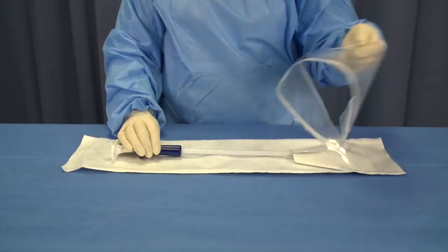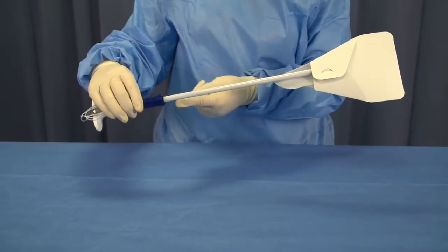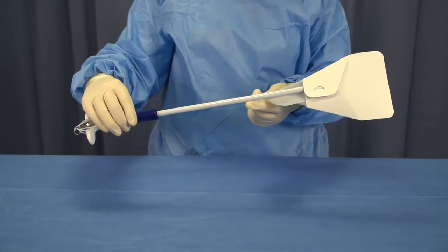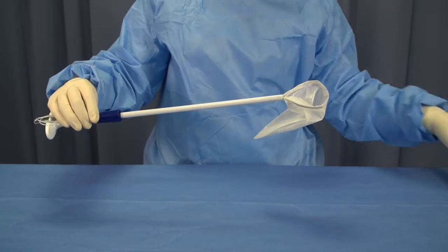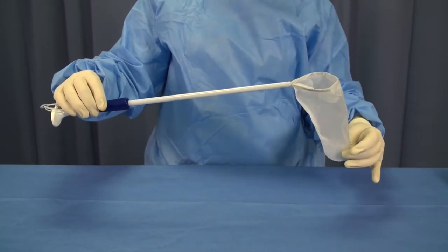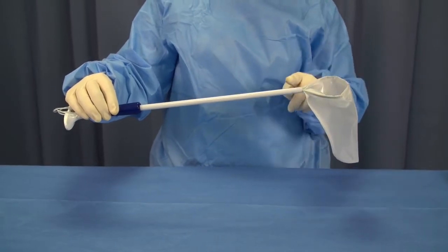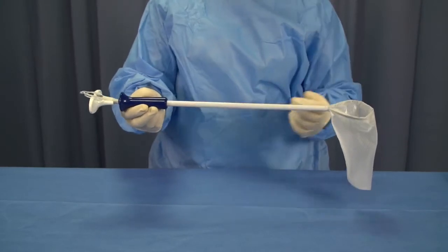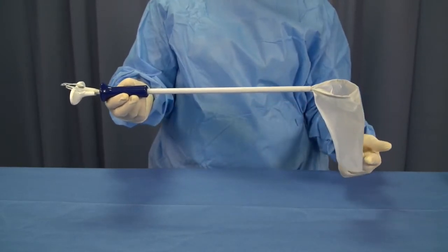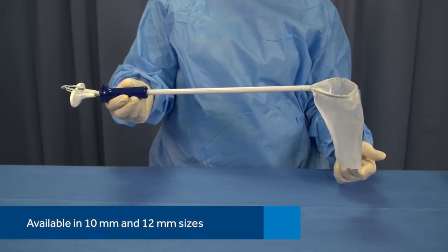First, let's take a look at the packaging. The Reliacatch Specimen Retrieval Bag consists of a long cylindrical tube and a ripstop nylon bag that comes deployed in the packaging. The bag is used to encapsulate and contain specimens for removal from the body cavity. The device includes a fork handle used to retract and deploy the bag. The specimen bag is designed for introduction and use through all appropriately sized Trokar sleeves. The Reliacatch device is available in 10mm and 12mm sizes.